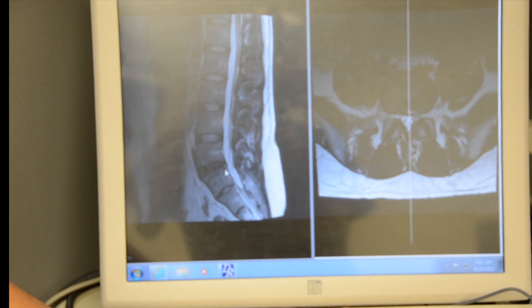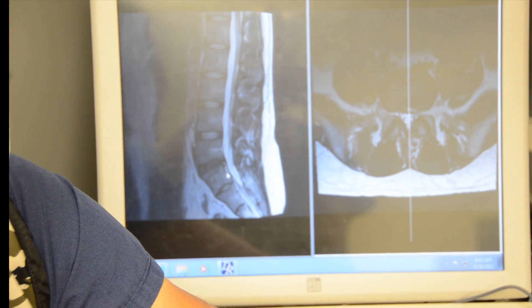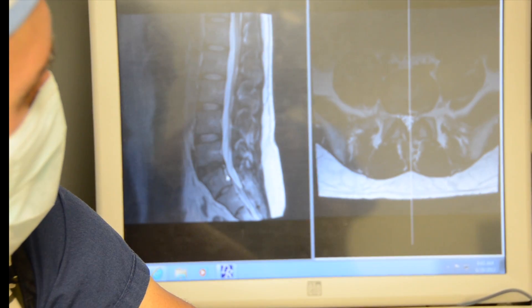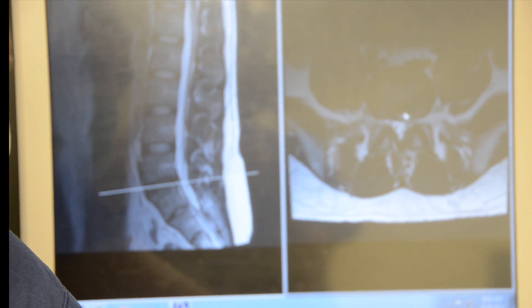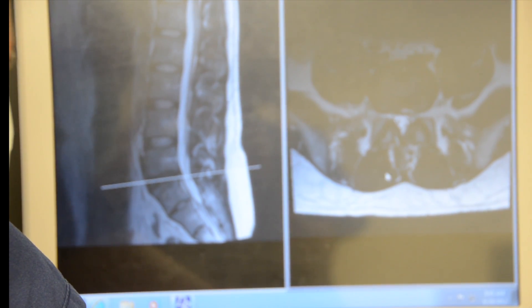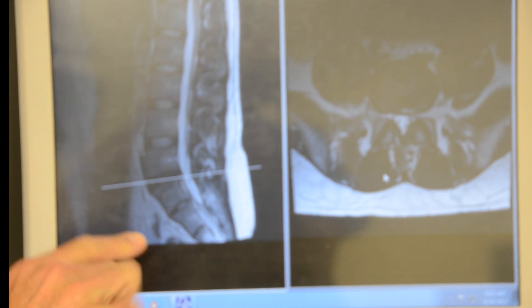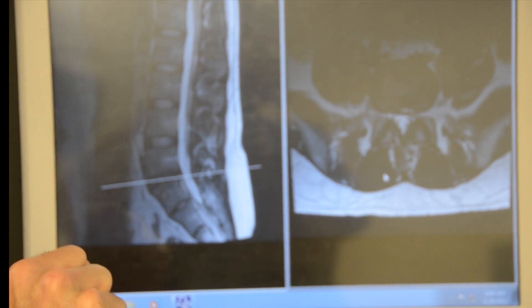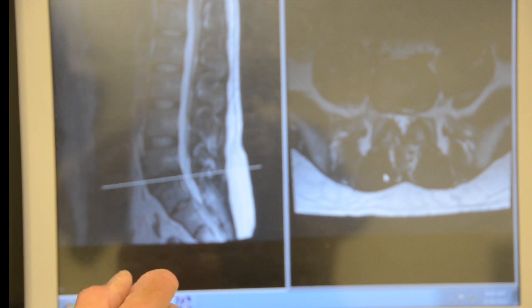You can see the disc protrusion right here. He's undergone a multitude of non-operative management without success and continues to be hurting with his low back pain. Here's the disc — an axial view showing the disc sequestered into the annulus. What we're going to do is go in through the front of the spine, retroperitoneal approach, take out the lumbar disc at L5S1, prepare the disc space for an artificial disc. In this case I'm using the Synthes ProDisc L, which is a mechanical device.